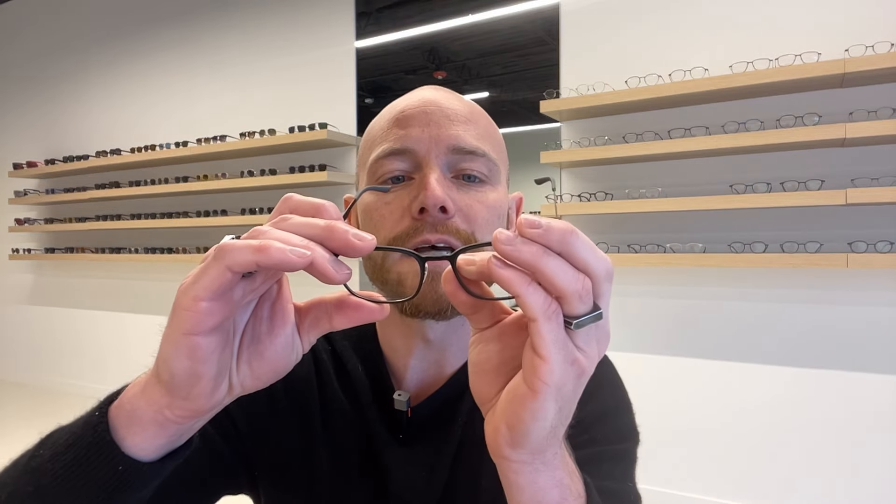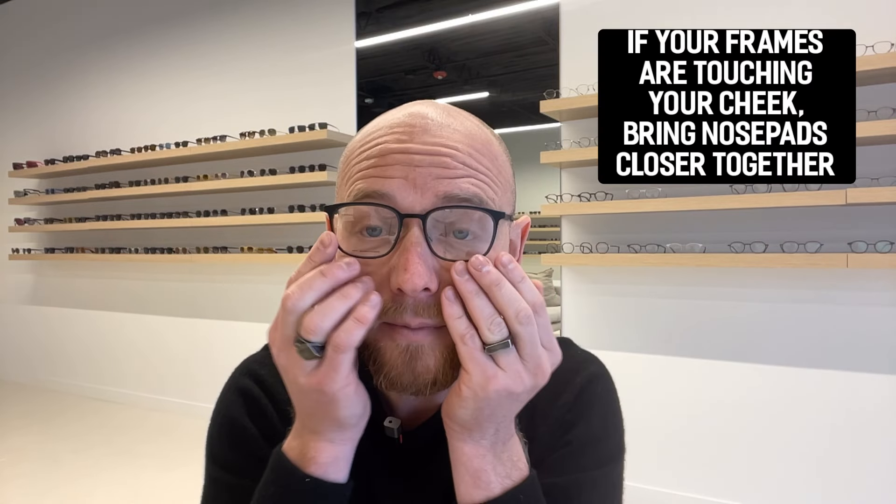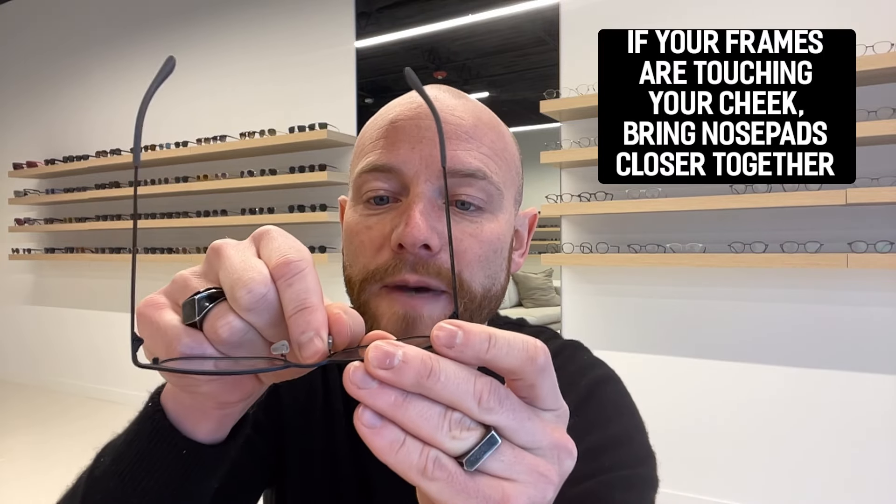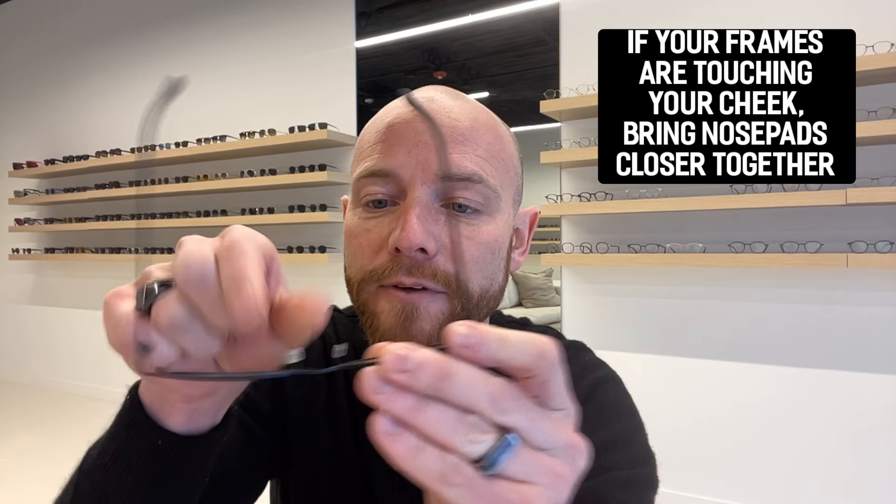If the pads are sitting too far apart they can come down and touch your cheek, and when you smile it can move the glasses up and down. That's frustrating, but it's a simple nose pad adjustment — just bring those pads in a little bit to raise the frame off your cheeks so you're more comfortable wearing that pair of glasses.